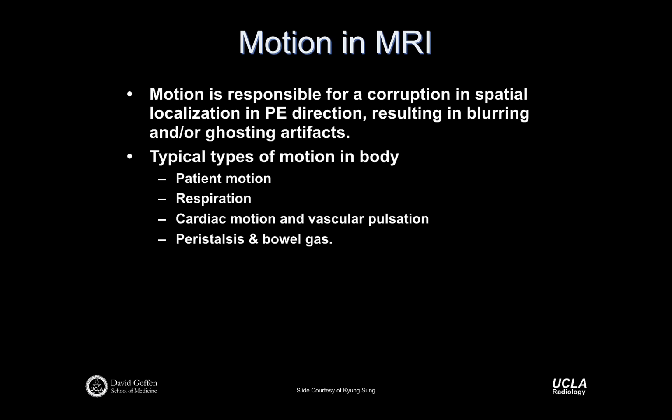So patient motion, you can certainly deal with it, so to speak, just through coaching the patient and saying, look, this is really important, and when you hear the scanner buzzing and clicking, it'd be great if you could hold as still as you can. Right? So that can kind of be managed that way.